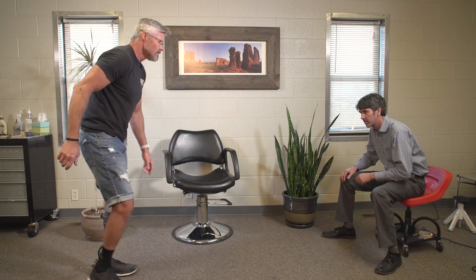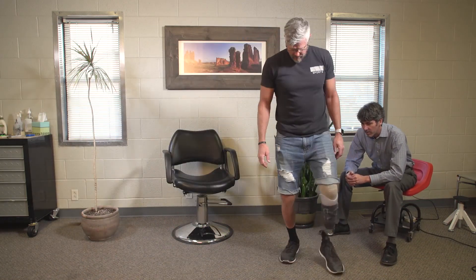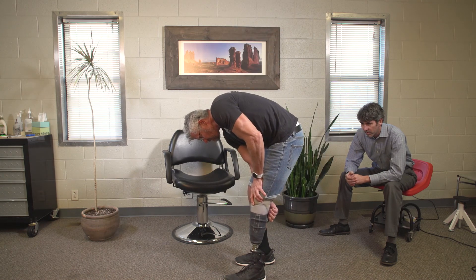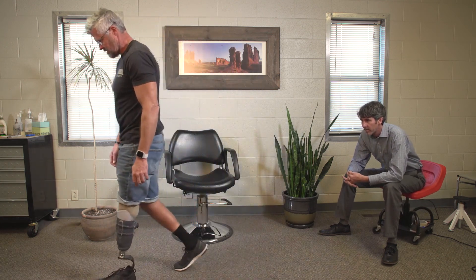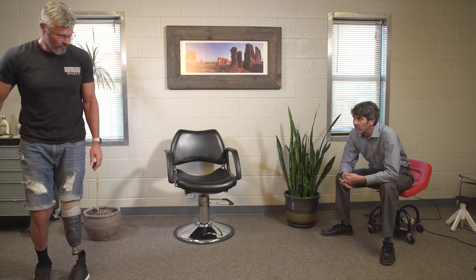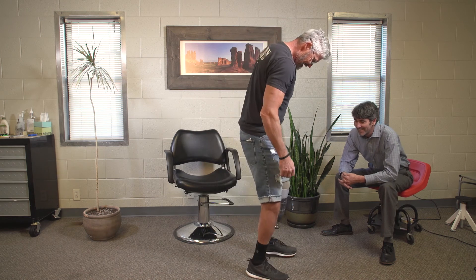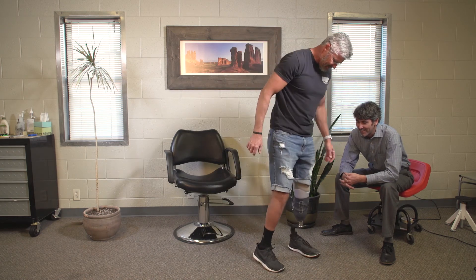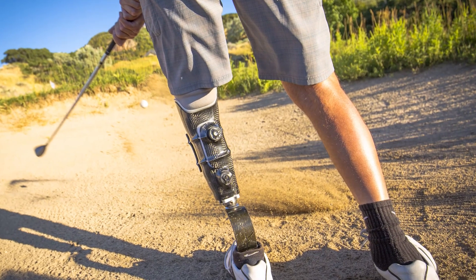Adjustability really is life-changing. For your patients, it means the freedom to get out and live their lives to the fullest, whether that's climbing a mountain, or simply being comfortable at a long day of work. For you, adjustability means you are building sockets that fit today, tomorrow, and every day. So, instead of trying to make a rigid socket fit a limb that has changed, you can move on to better things, like seeing new patients, or sneaking out of the office for a round of golf.